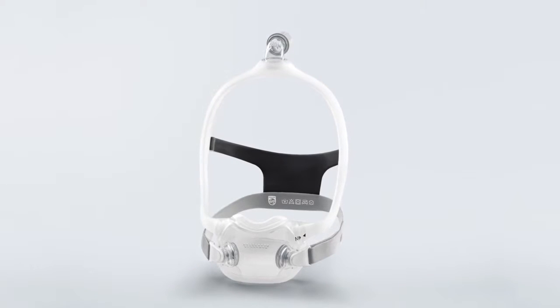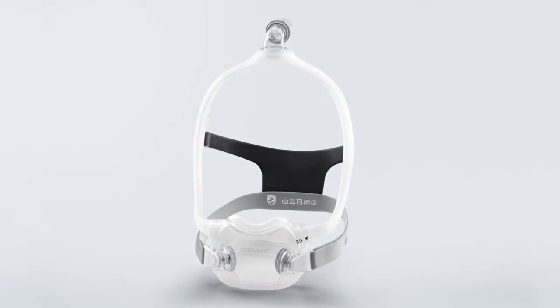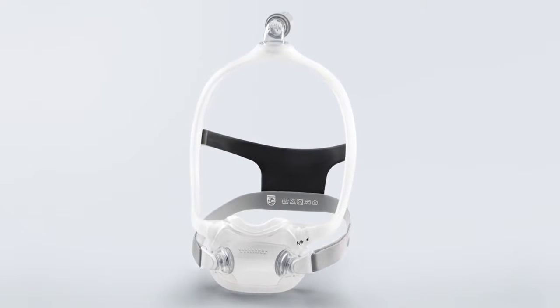Cleaning the Philips Dreamwear full-face frame, cushion, elbow, tubing quick release, and headgear before first use is very important.